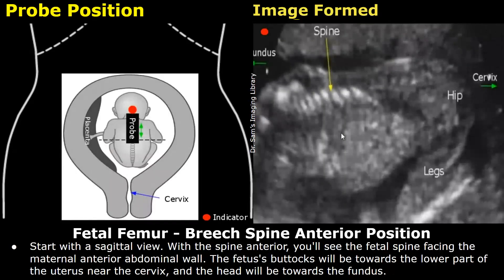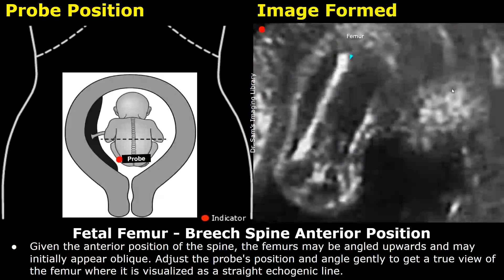Now we will see how to locate the femur in a fetus that is in a breech position with anterior spine. Due to the anterior position of the spine, the femurs may be angled upwards and may initially appear oblique. Adjust the probe's position accordingly and angle gently to get a true view of the femur, where it is seen as a straight echogenic line. It can be difficult to obtain a horizontal orientation of the femur in some cases, so try to adjust the probe to get the best view possible.